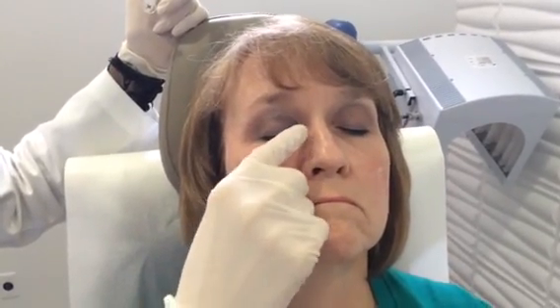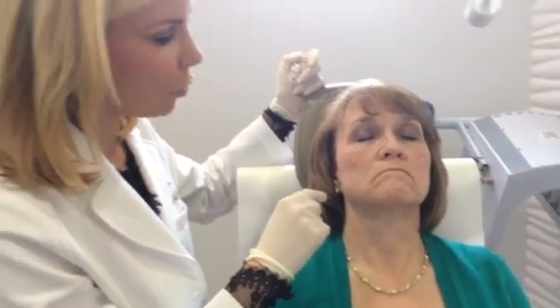You can see I used about 1/3 of the Restylane just in this area, just to give a nice softening of it. One of the things that happens with tear troughs is you get a little bit of what we call hemosiderin pigmentation from the skin being really thin and little blood vessels traveling through it. If you give a little bit of volume back, over time sometimes even that pigmentation softens, but she no longer has any shadow. She's not overcorrected. That's perfect, and that's just where we want her to be.